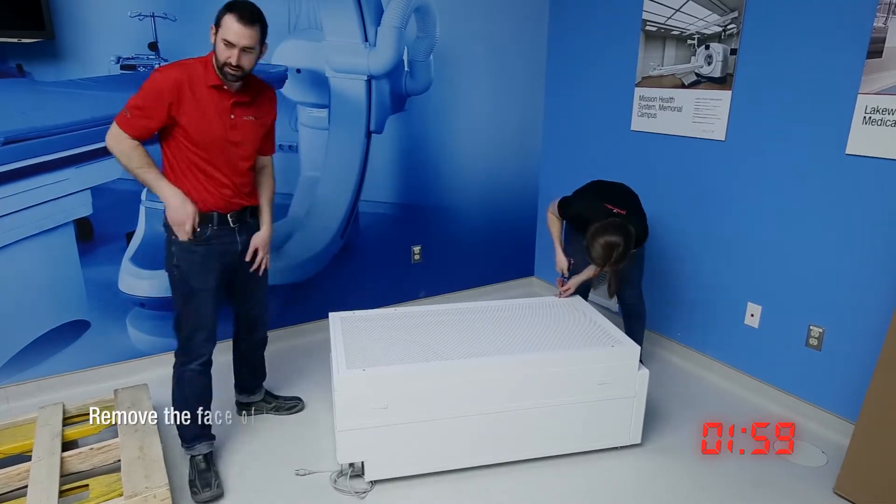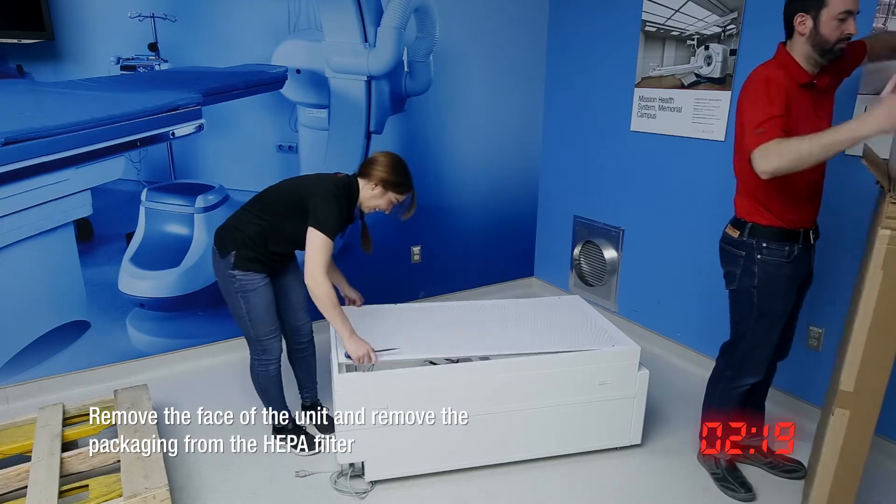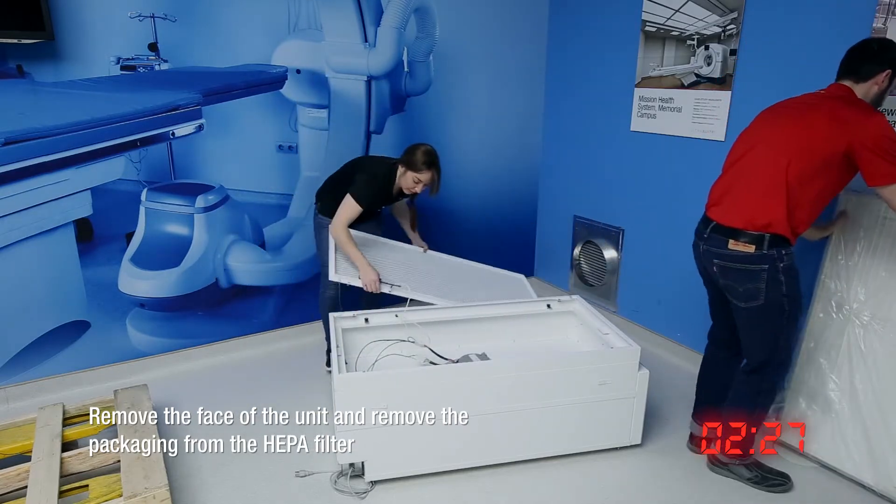Then, using a flat screwdriver, disengage the quarter-turn fasteners and remove the face of the unit. Also, remove the HEPA filter from its packaging.